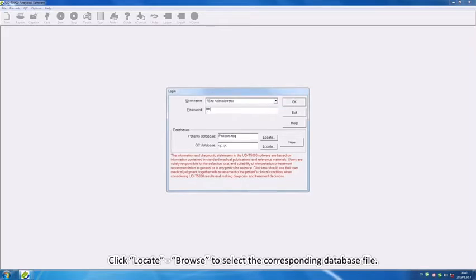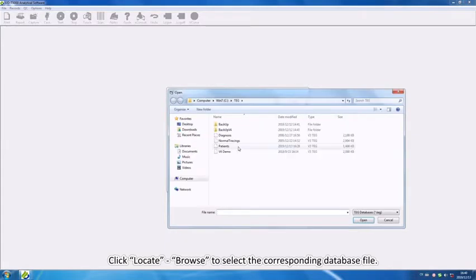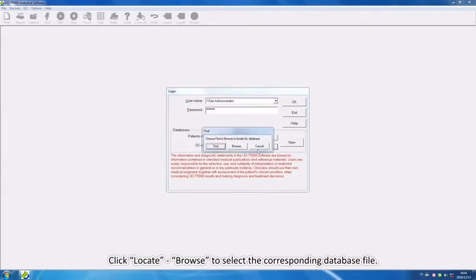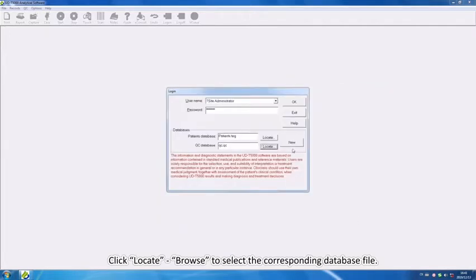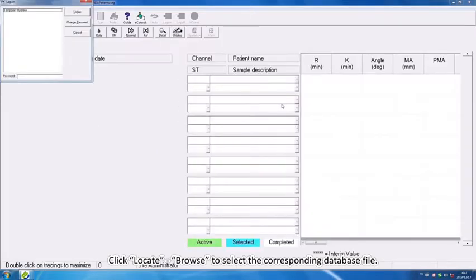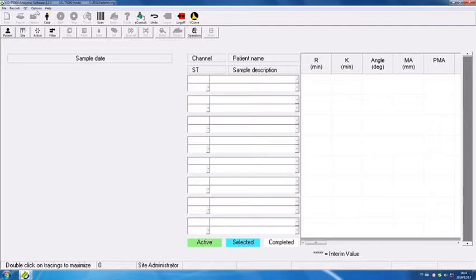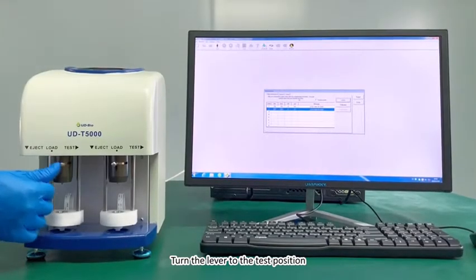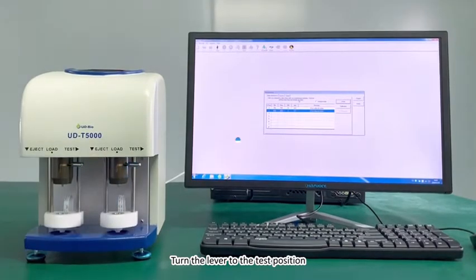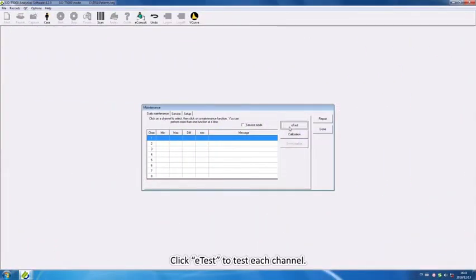Click Locate to select the corresponding database file. Turn the lever to the test position. Click E-test to test each channel.